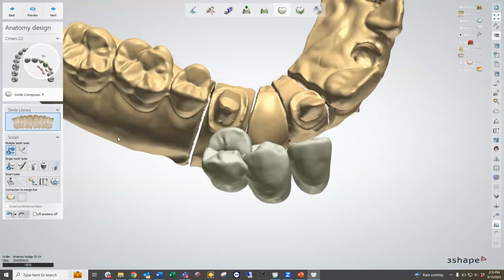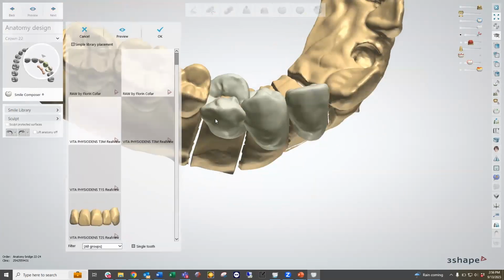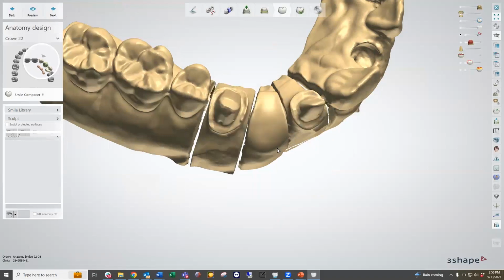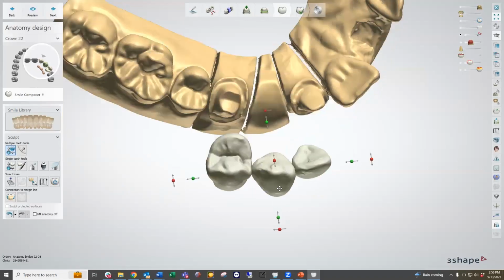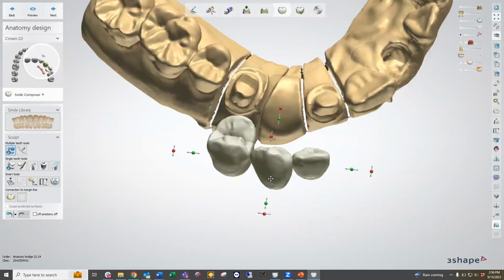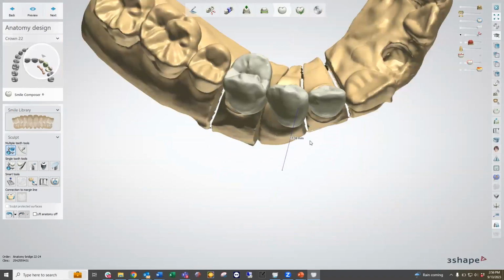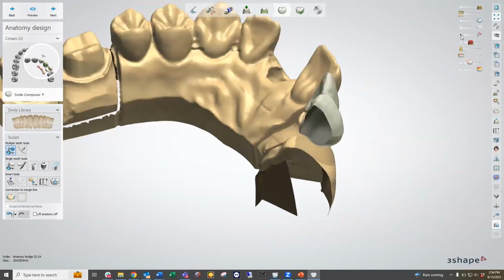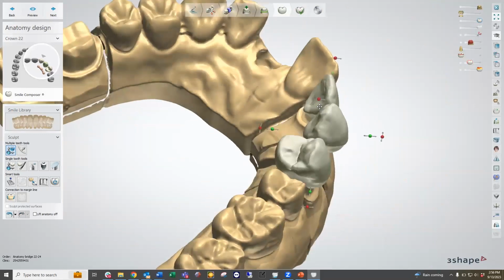So maybe this one's not the greatest one because the idealization of the crown's kind of messed up a little bit. So I'm going to choose just this one here real quick. If I choose a new library, it basically brings in the teeth anew based upon the library that we chose. Allows us to go ahead and select what we want. So I'm going to go ahead and put them in. Left that on from the last one and put them into position.